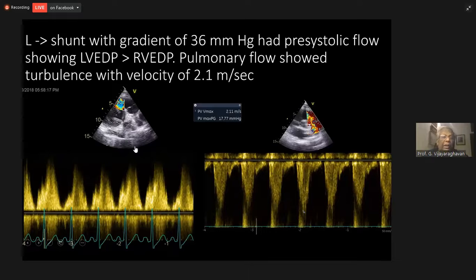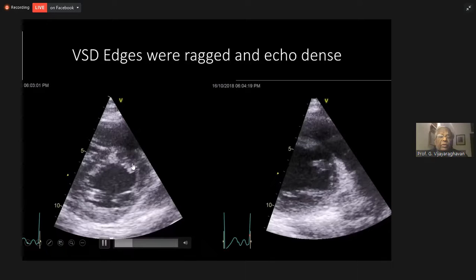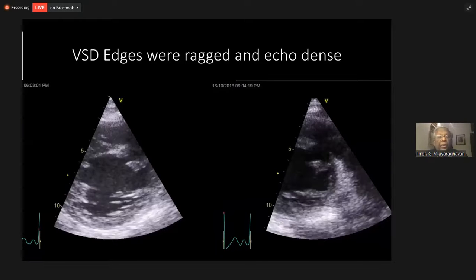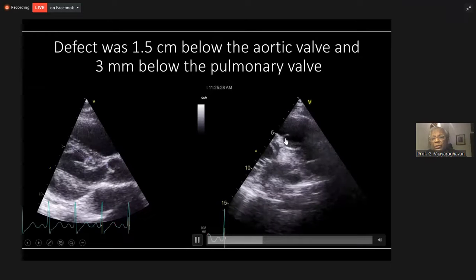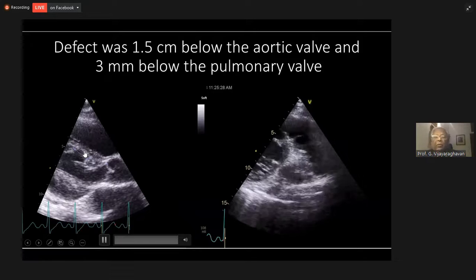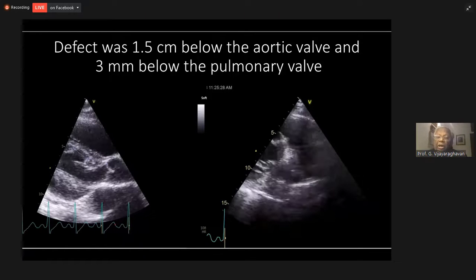And you can see the ragged edges of the ventricular septal defect. I've seen a similar ventricular septal defect a couple of years back, where also the ragged edges of the defect indicate that this is a ruptured ventricular septum and not a pre-existing ventricular septal defect. And we found that it is very close to the pulmonary valve, just 3 millimeters. It's in the opening into the RV outflow tract. Hence, because of proximity to the pulmonary valve, we were unable to do a device closure of this defect and decided to take him up for surgery immediately, at night itself.